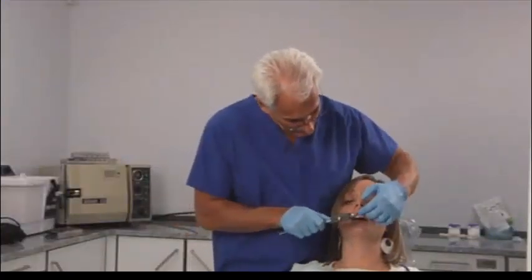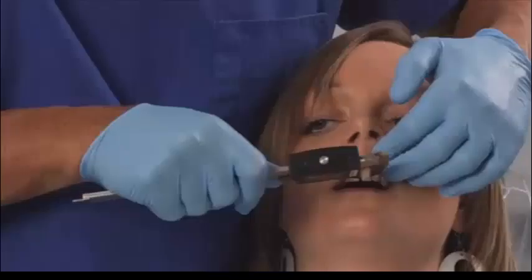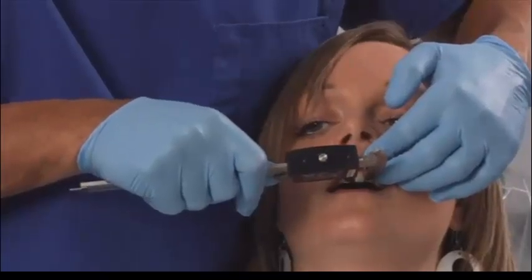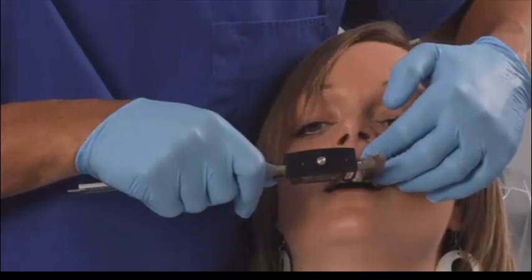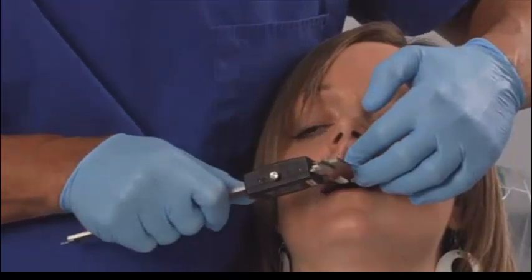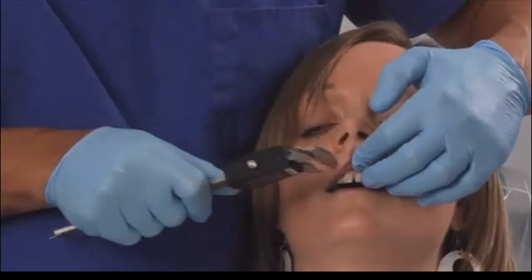So I'm going to measure you with this digital caliper. I'm measuring both central incisors, and Caroline has a diastema, so I'm going to measure half the diastema as part of her calculation for her central incisor width. I'm going to enter that into her patient file.